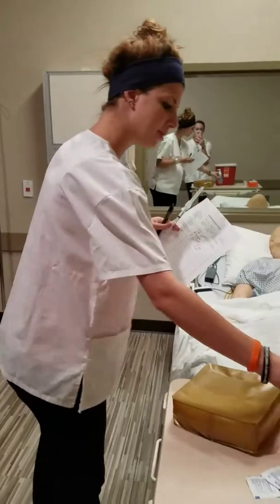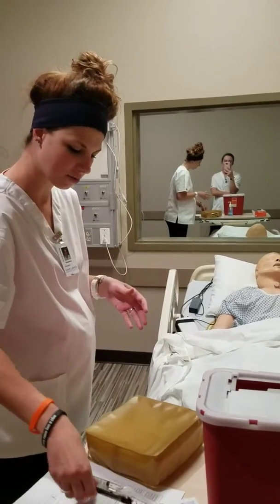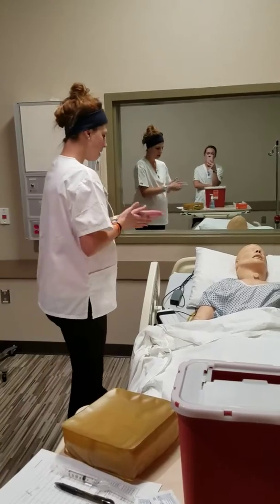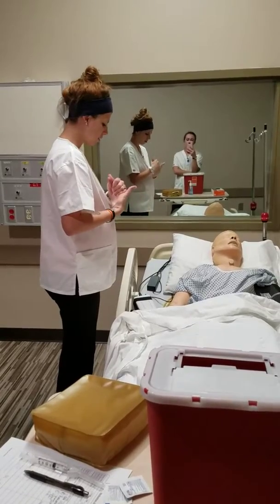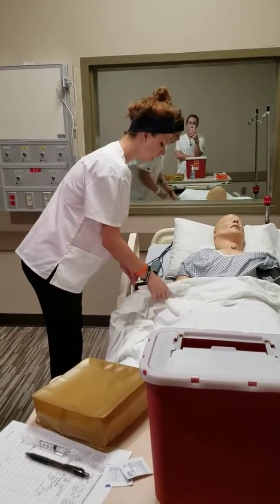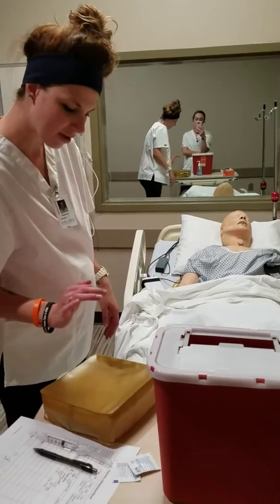Knock, knock. Hi, Mr. Brown. My name is Stephanie. I'm going to be your nurse today. We're going to be doing an intramuscular injection. Hi, Jean. I heard you were complaining of nausea, so this will relieve the nausea for you. Can you say your name and date of birth? That matches what you have here on the bracelet, and it matches what we have here on the chart.